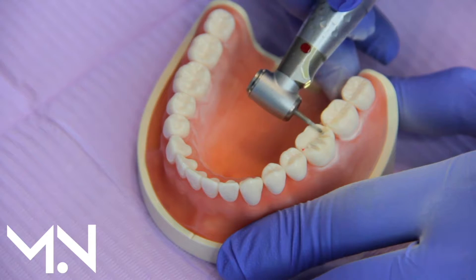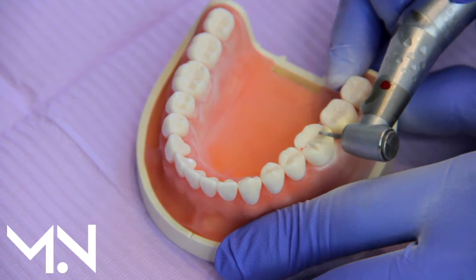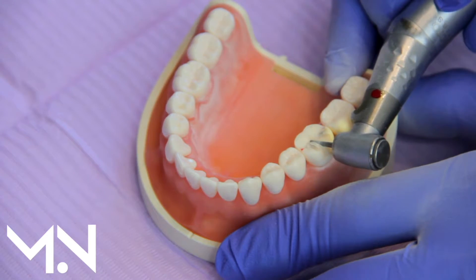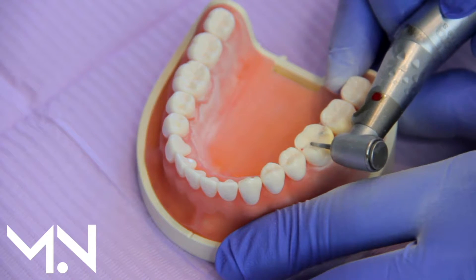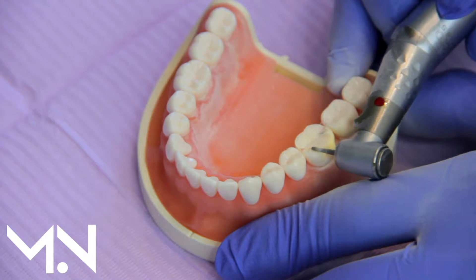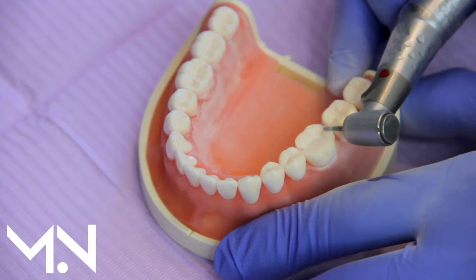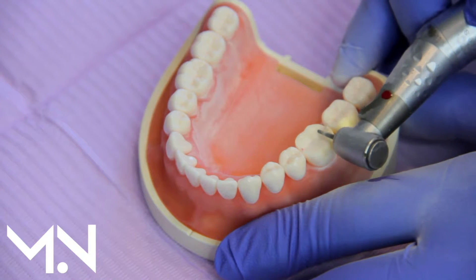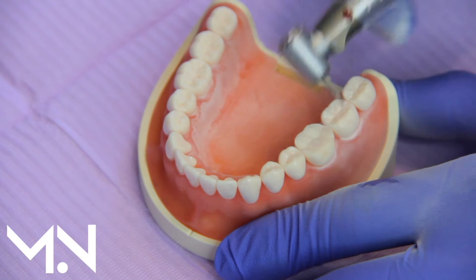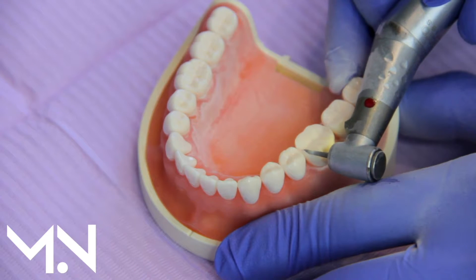As you can imagine, we have a lot of tooth reduction here that could have been avoided, and we're not even done yet. This is called the occlusal reduction — that's how much we need to take off the top so that there's room for the crown.